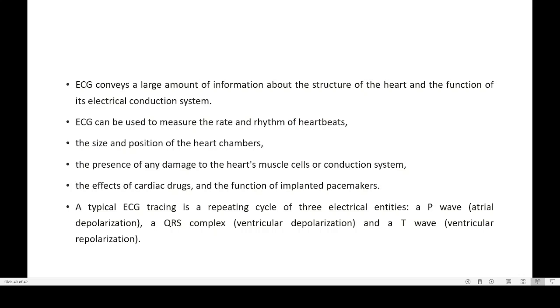They insert a battery-like apparatus that will be placed here under the skin, on the shoulder part, by making a small surgery. It is actually a battery-operated structure. The battery can last 5 years or 10 years. It produces an electrical current. That electrical current is taken by a wire and touches the heart muscle at the SA node.